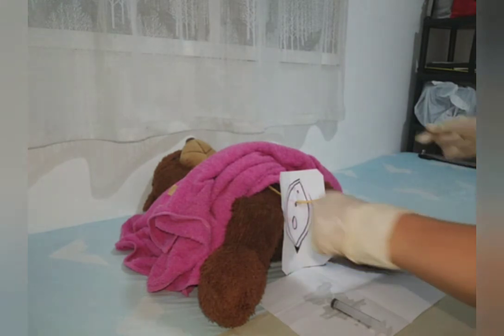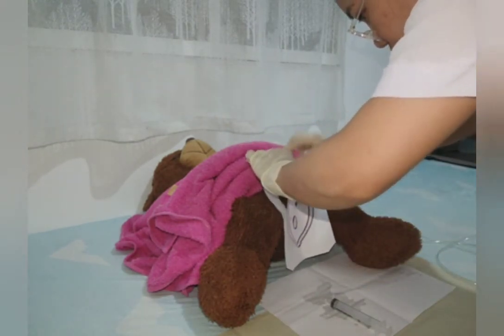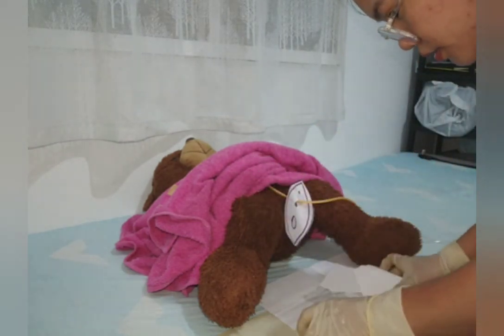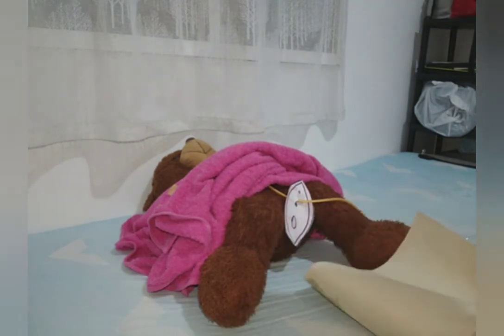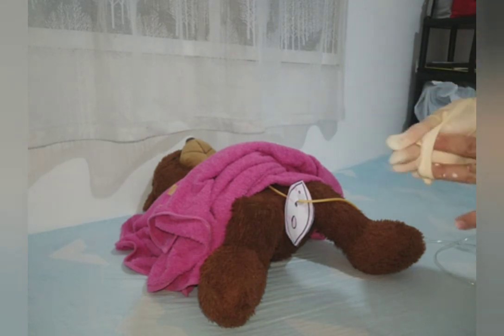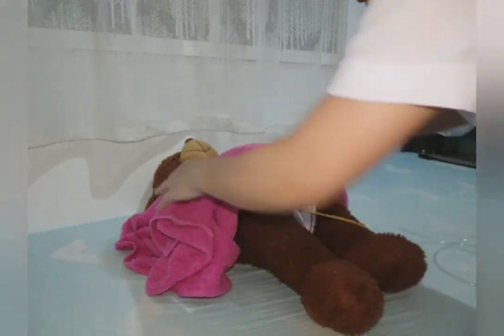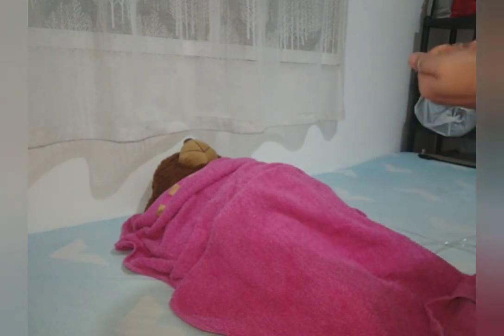I will dispose everything. I will dispose the material used, and make a clean area, and dispose the syringe in a disposable bag safely. And remove my gloves. Position the client into a comfortable position. Thank you, ma'am, for your cooperation. I hope you are feeling better now. And I'll perform the hand hygiene.